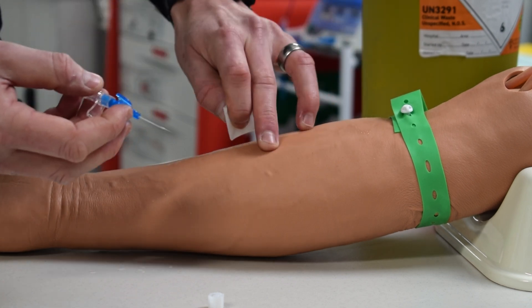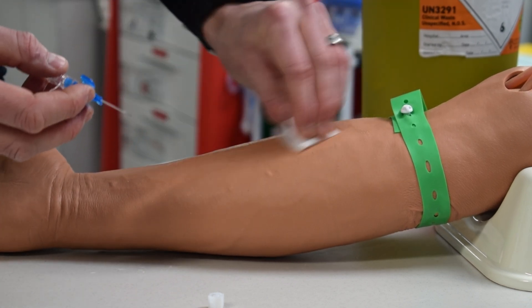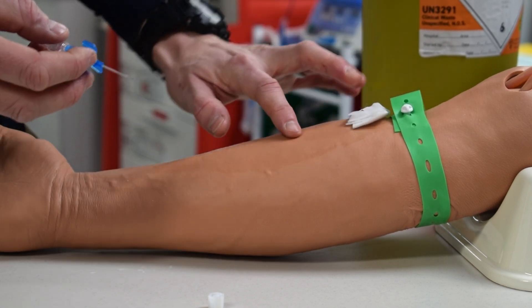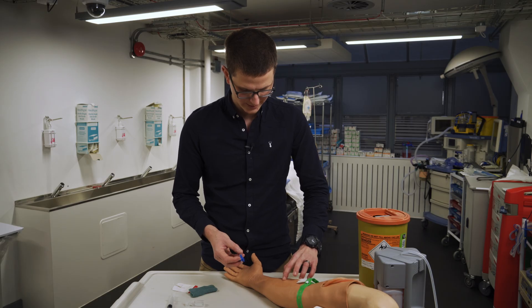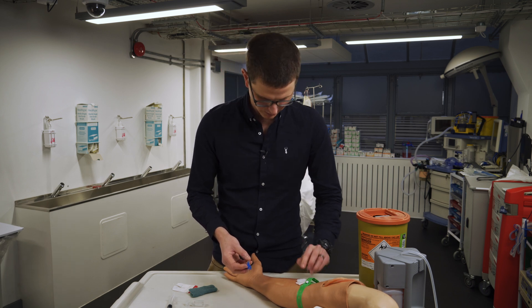Cleaning methods — there's a basket weave, there's the circular weave, there's all sorts of ways of doing it, as long as it's clean. Now that it's clean, we have our vein — it feels like a round ball that when you push down it kind of bounces back up. That's exactly what we want.